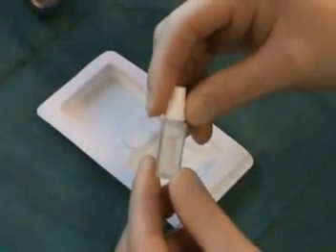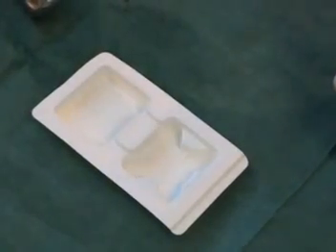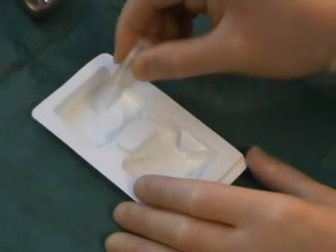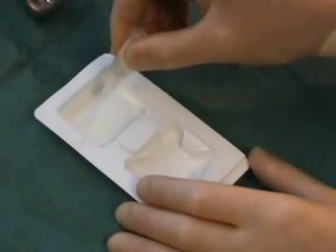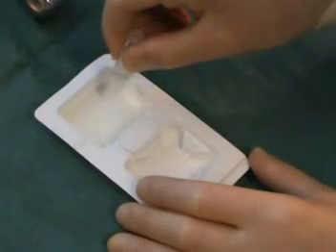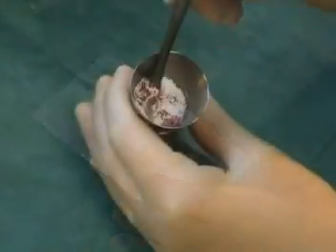A small plastic bottle of plasticizer is also provided with the package. The entire contents of the bottle should be emptied onto the membrane in compartment A. This should then be left for 20 to 30 seconds.